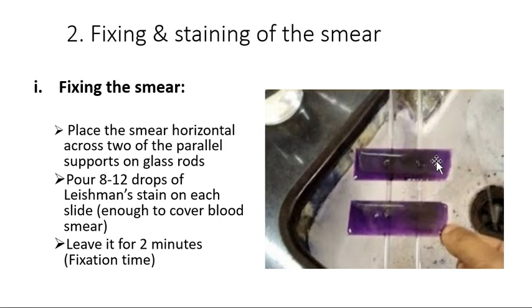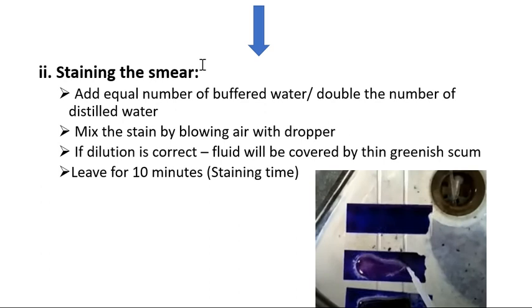Okay guys, this 2 minutes is called fixation time. During this time, acetone-free methyl alcohol will fix the smear to the slide. Okay, that's why this is fixation time. After that the stain will act. So the Leishman stain part, which is the acetone-free methyl alcohol, fixes the smear on the slide. That's why it's called fixation time. Now next is staining time.